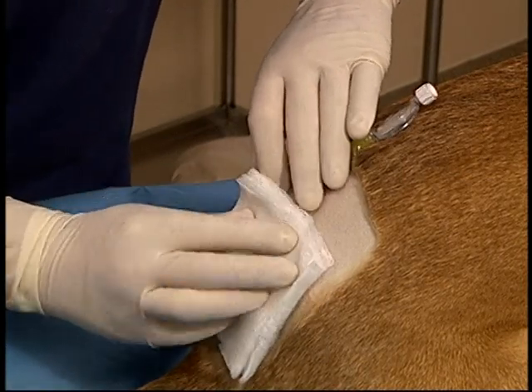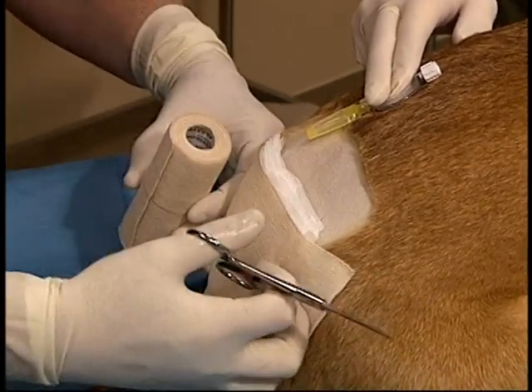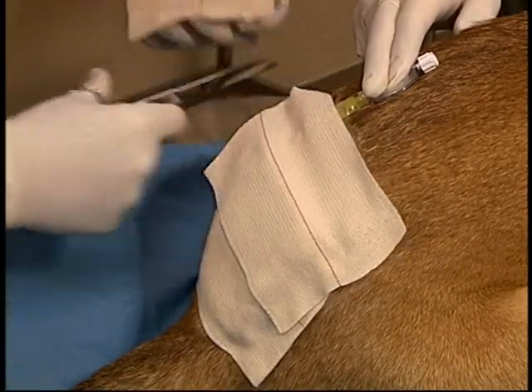Once an appropriate stress loop has been created, the remainder of the catheter is coiled underneath the dressing, triple antibiotic is applied, followed by sterile 4x4s, and either Elasticon or other water repellent dressing is stapled to the skin to hold everything in place.